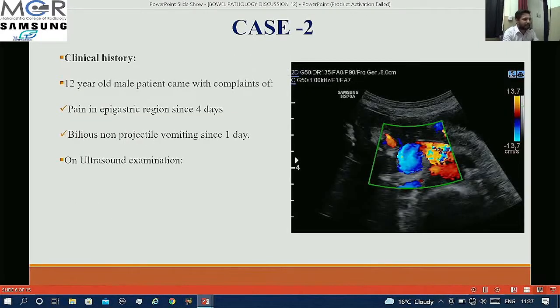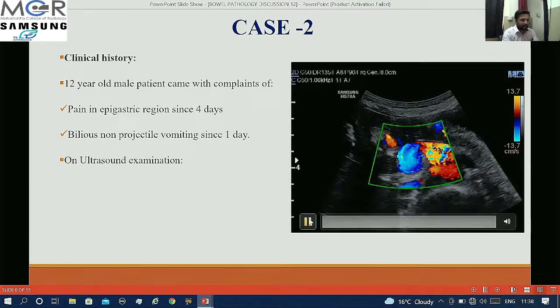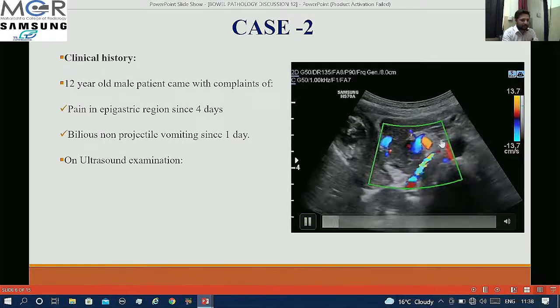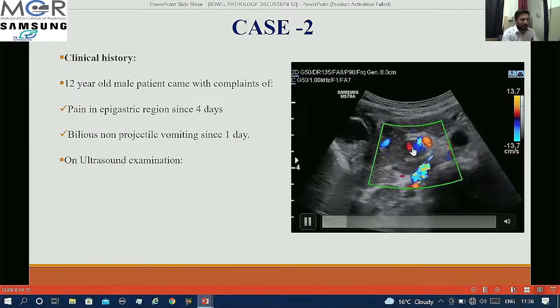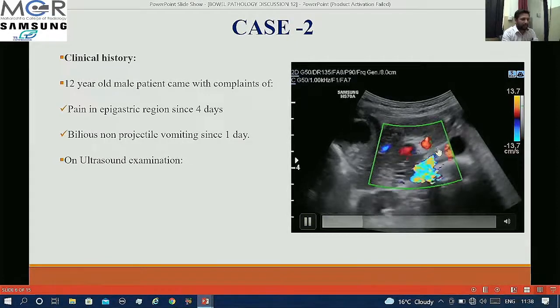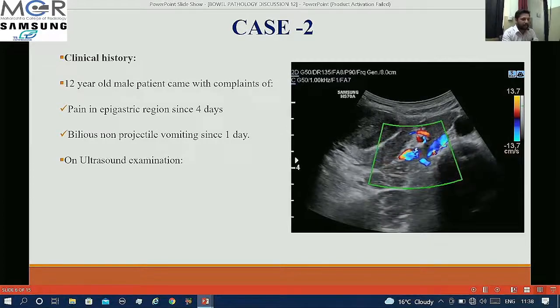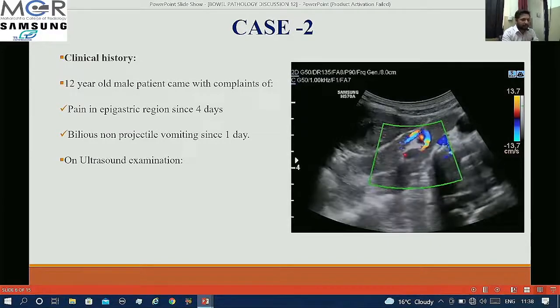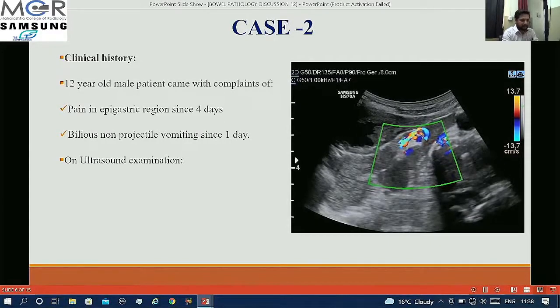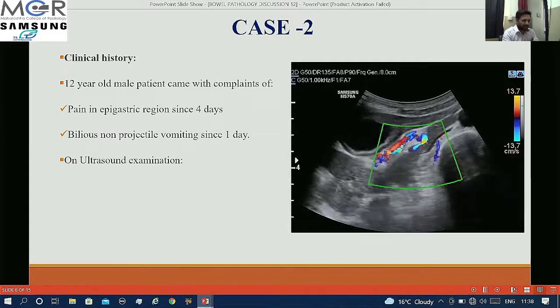This is case number 2. A 12-year-old male patient came with complaints of pain in the epigastric region and bilious non-projectile vomiting since one day. On ultrasound examination we can see twisting or swirling of bowel with mesentery, along with significant alteration in the relation between SMA and SMV.